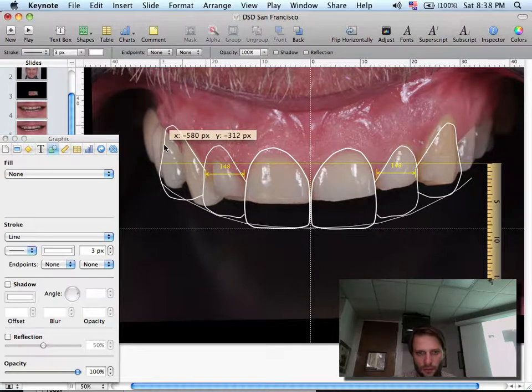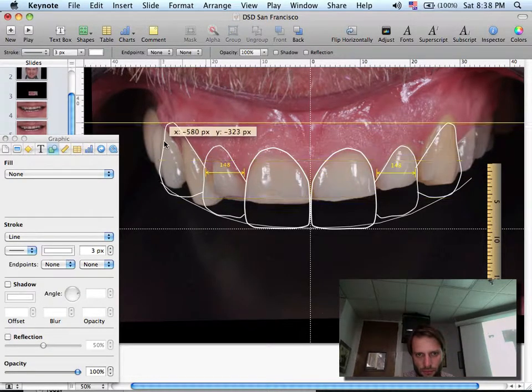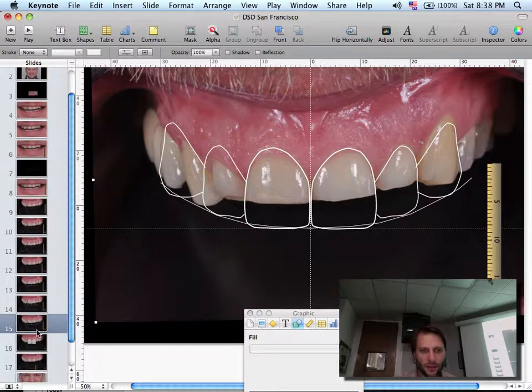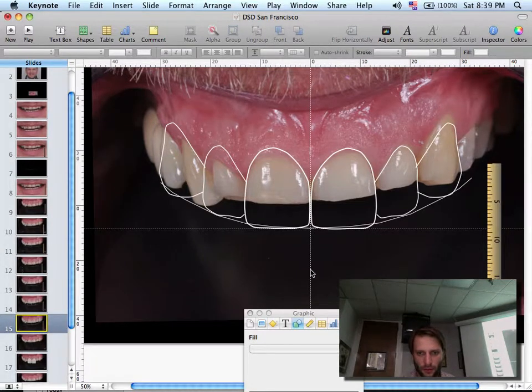And then we see that this is not going to work. We can see that the cuspid is completely off. Now this is something nice. Let's say that for any instance we decide on doing ortho over here, or we want to show the limitations, that the two cuspids will never look the same. So what we can do here is this. Look at the cuspids. Look at the midline.